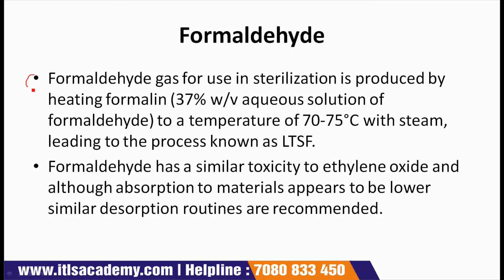So the very first point is, formaldehyde gas for use in sterilization is produced by heating formalin, and this is 37% weight by volume, weight divided by volume.